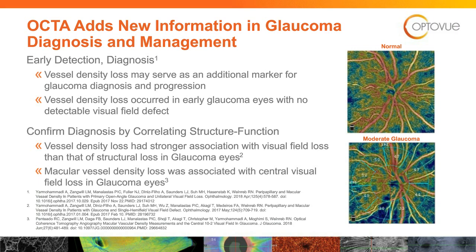references that are here, for example, the first reference, they did an amazing job because they looked at 3 different groups of individuals. One group had glaucoma, and they broke them up. One eye had visual field defect. The other eye had no visual field defect. And then, so one group was the eye with the visual field defect. Second group was the eye without the visual field defect. The third grouping was age-matched normals.